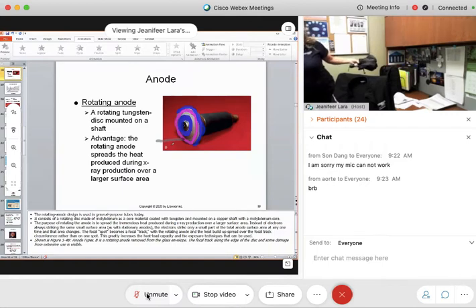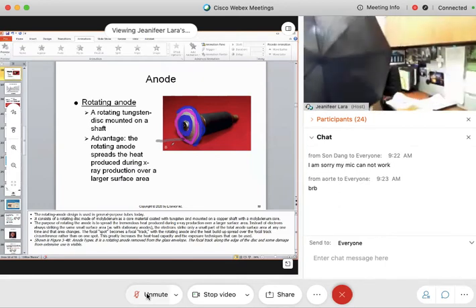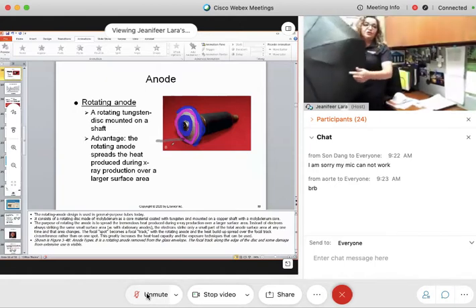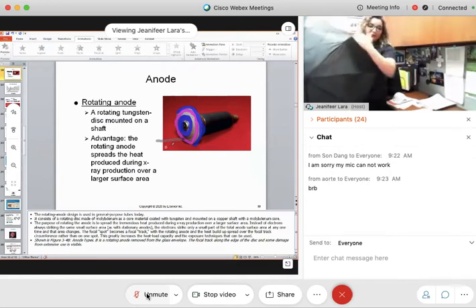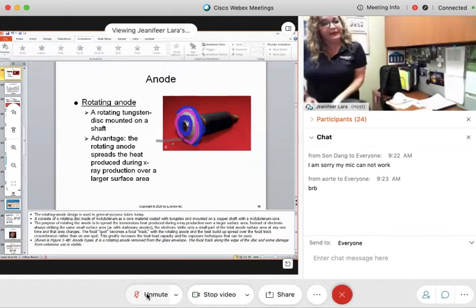Okay, y'all ready? Ready to be amazed? Can you see me? I have an umbrella. And if you were going to aim a gun and shoot in the same place and you never move your gun, what's going to happen? It's going to shoot different parts of the umbrella because it is spinning at the same time. It never stops spinning because heat is dissipating.